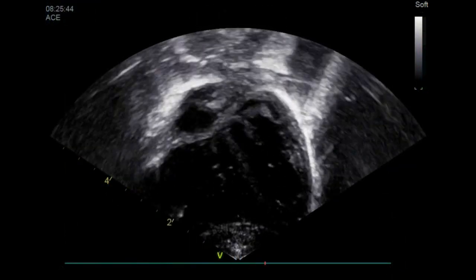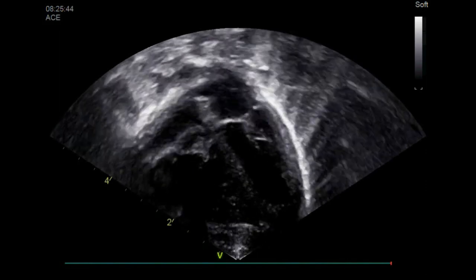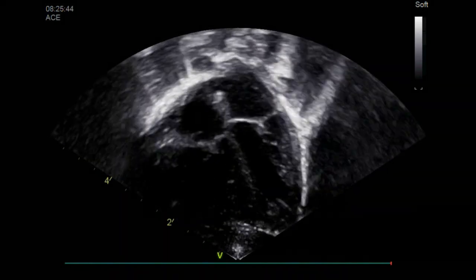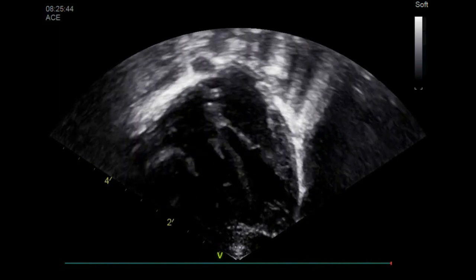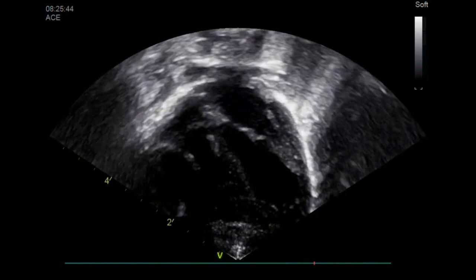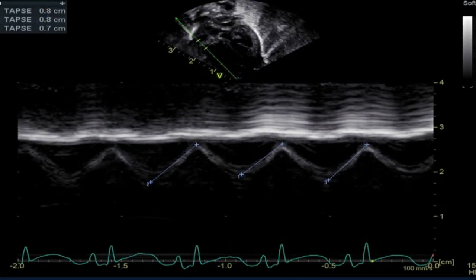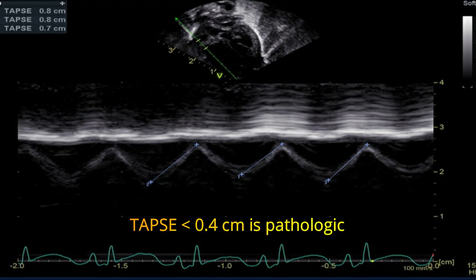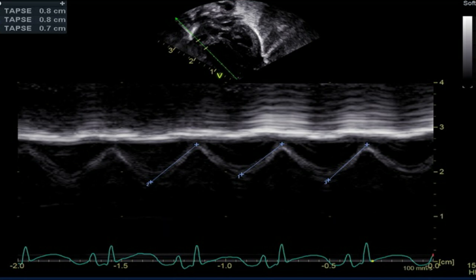Tricuspid annular plane systolic excursion (TAPSE) is a measure of right ventricle longitudinal function, obtained from the four-chamber view using M-mode with the cursor aligned along the direction of the lateral annulus. It provides useful information about longitudinal fiber shortening and has shown good correlation with techniques estimating right ventricular global systolic function. A diminished value below 4 mm is predictive for the need of ECMO and death in infants with PPHN.